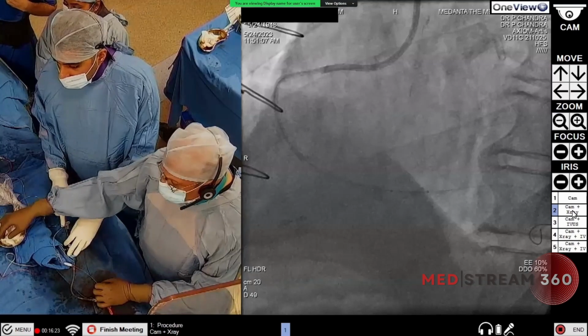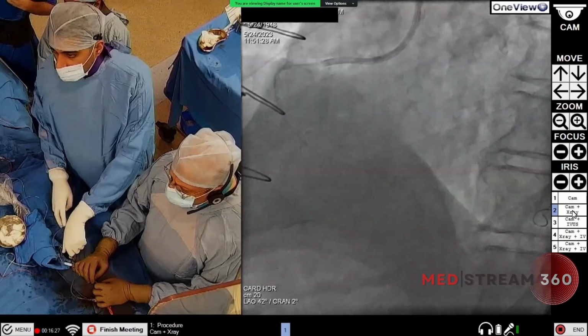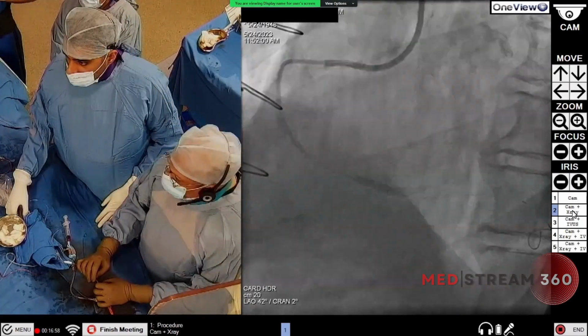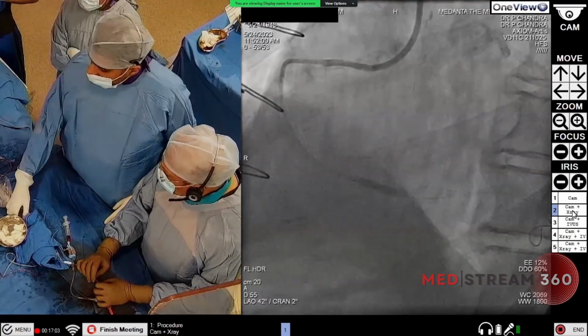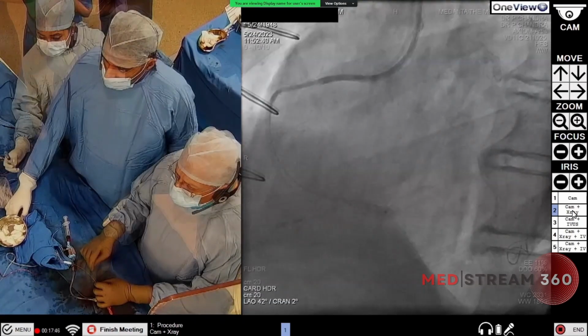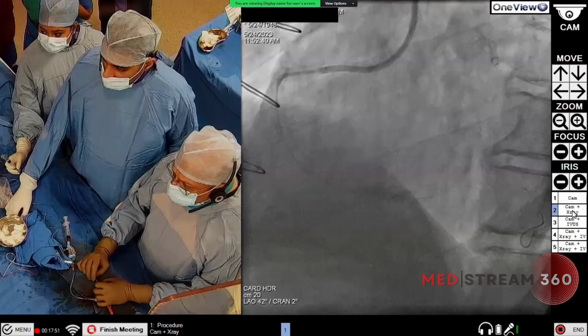And then other options are orbital atherectomy, but I don't think, again, it is a good idea to do orbital atherectomy here. So we are giving the third. This is now the fourth set. We have done deflate, please. So I have pulled back the guide liner also a little bit, the guide +2.